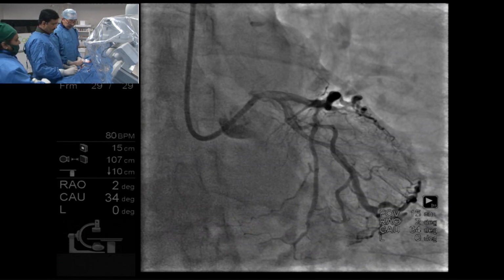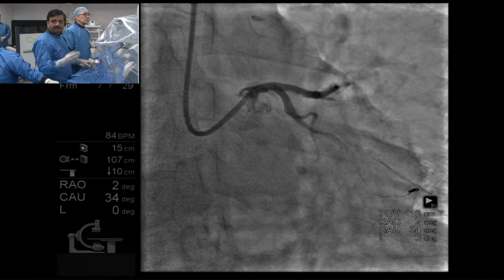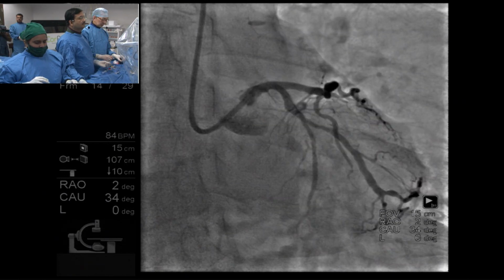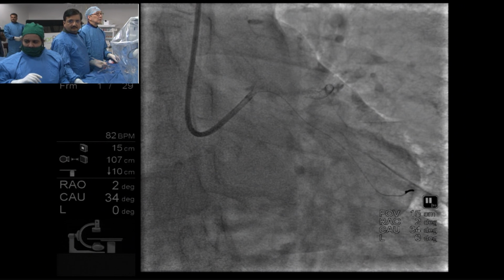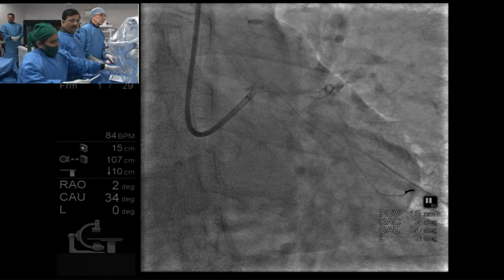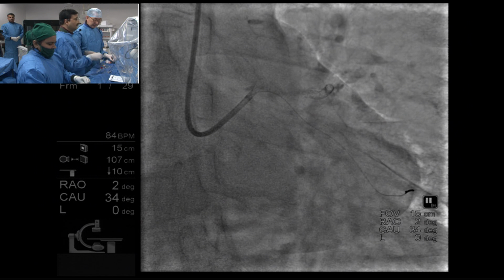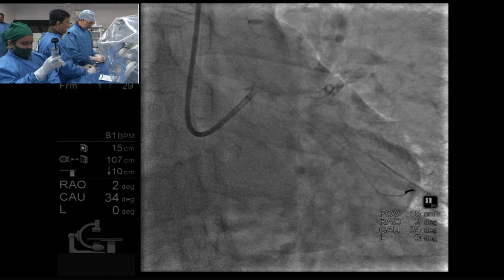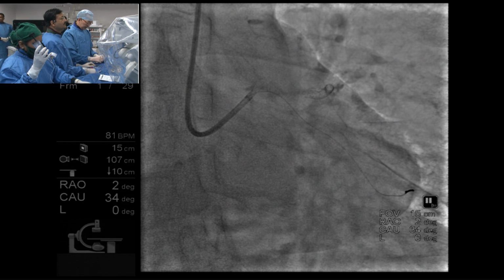I think the lesion is moderate, around borderline, we can say 50 to 60%. Are there any ECG changes in the lateral area, like ST depression in V4 to V6? Do we really have to put a stent in the circumflex, or do you need the FFR or IVUS for teaching purposes? From this image, it looks like more than 60, I think at least 80 here. Why not IVUS? You have the catheter there and can see the MLA. We can IVUS, but the time is a little limited because we still have another RCA vessel to do, and this enormous RCA.